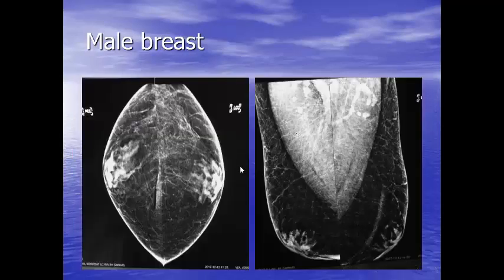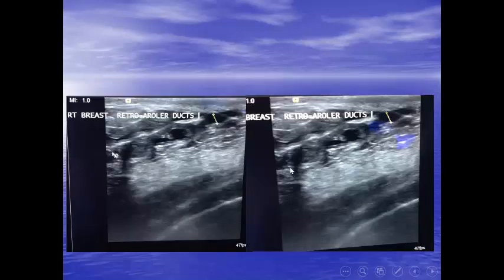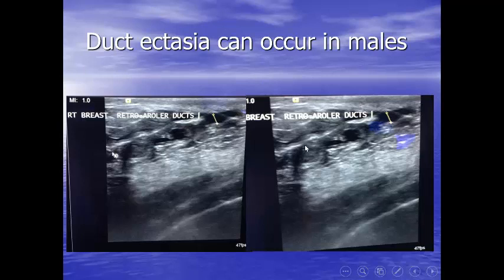Here is a male breast — this male presented with breast discharge. Tubular dense structures are seen retroareolar. Can a male get ductectasia? Yes, because males have ducts. This shows dilated ducts with thickened periductal mastitis — ductectasia with periductal mastitis. So ductectasia can indeed occur in males.